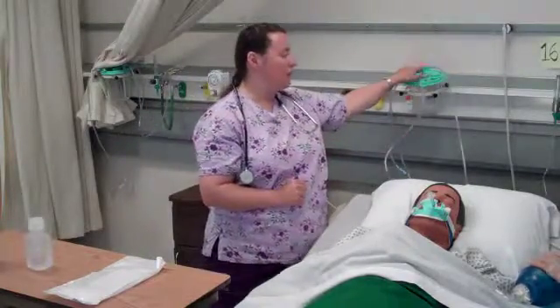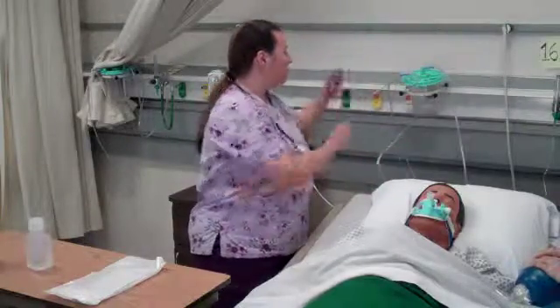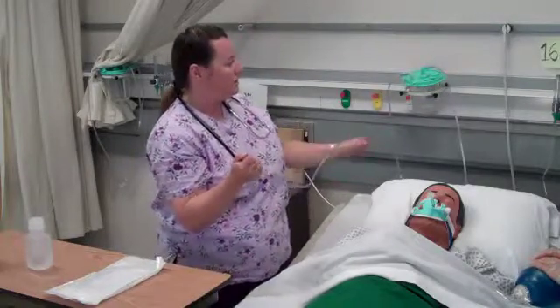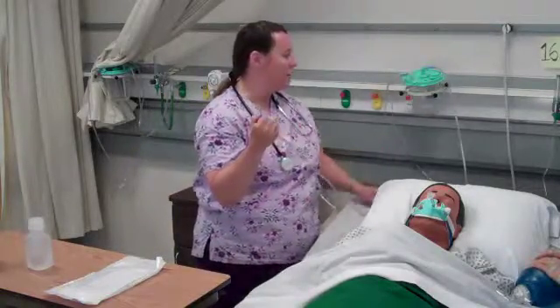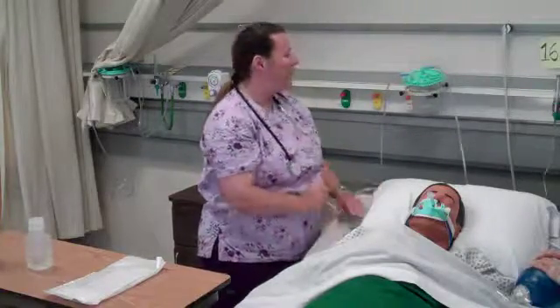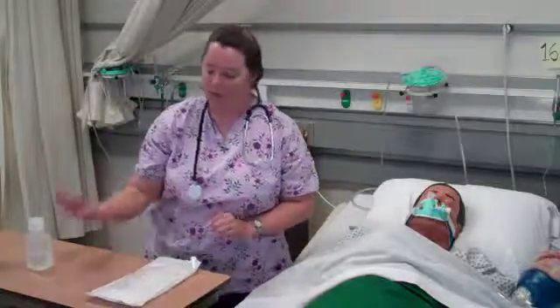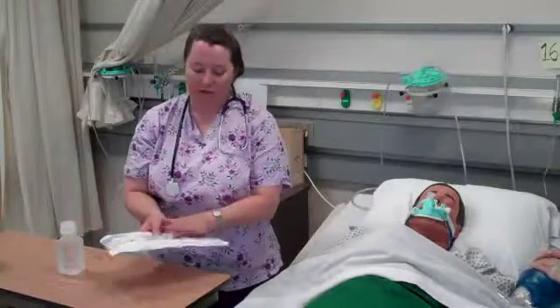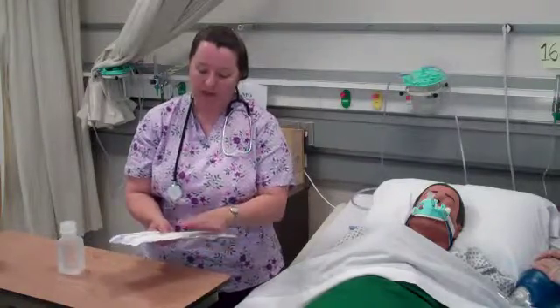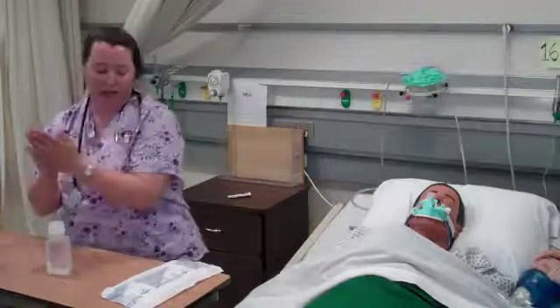I need to make sure that my vacuum source is available and working. I'm going to make sure that when I put pressure over the vacuum tube, it does not go above 120 millimeters of mercury for pressure. And I have that ready, set to go. I'm going to go ahead now and get my equipment ready here. I have made sure that everything is appropriate sizing, appropriate kit, and that nothing is expired on my equipment. I'm going to go ahead and wash my hands.